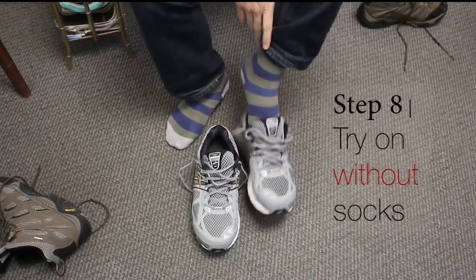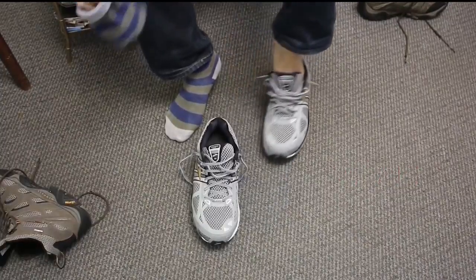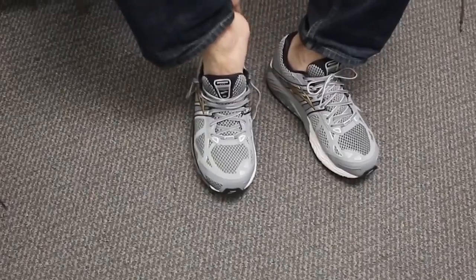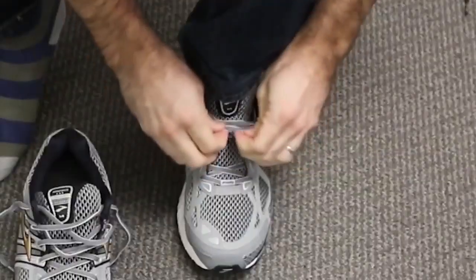Step 8. Try them on, but without socks. Just for the first few minutes of wearing their orthotics, have the patient wear the assembly initially without any socks. The patient should feel a comfortably warm shoe. Their bare foot is molding to the warm foam, which takes the shape of the foot.